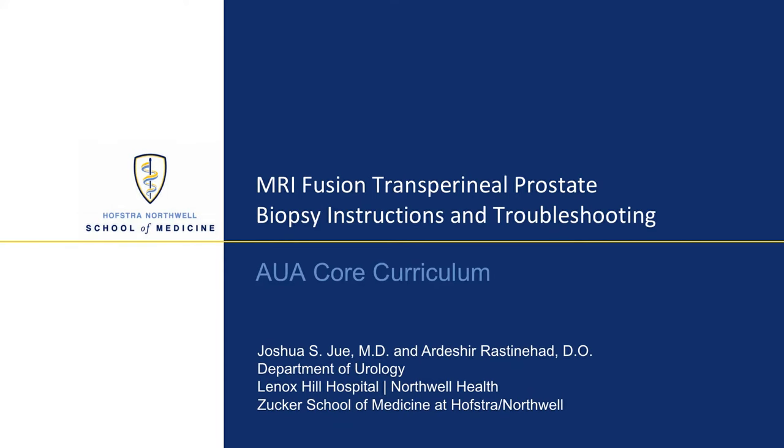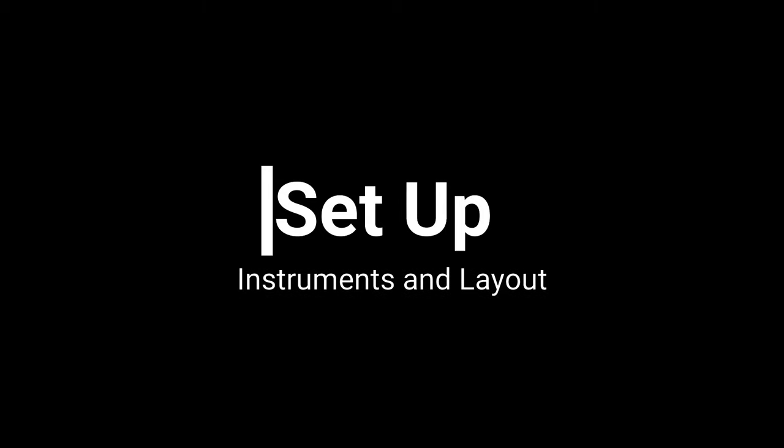Welcome to our video entitled MRI Fusion Transperineal Prostate Biopsy Instructions and Troubleshooting. In this video, we will show the instruments and layout for this procedure, as well as how to properly administer local anesthesia. The biopsy will be performed and common problems will be addressed in the troubleshooting section. We begin with the instruments and equipment layout required for this procedure.